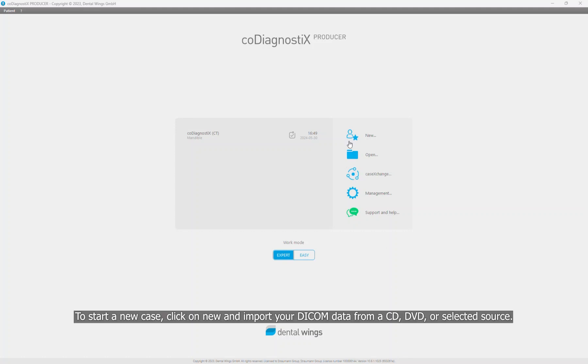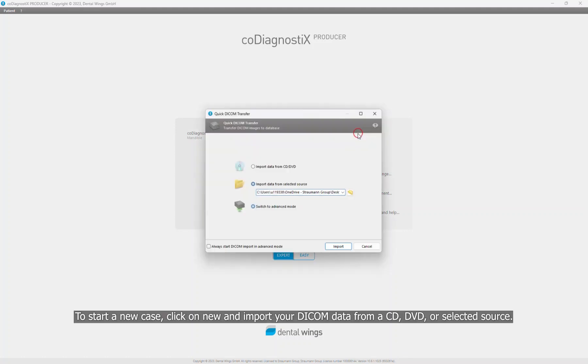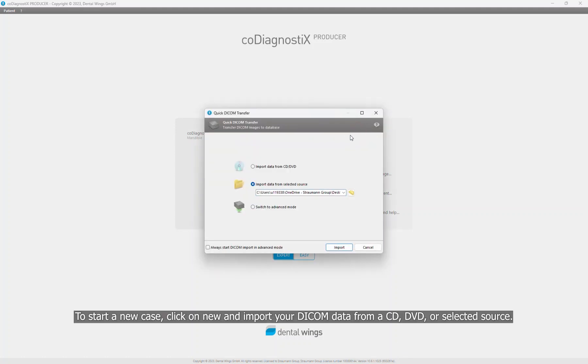To start a new case, click on New and import your DICOM data from a CD, DVD, or a selected source.